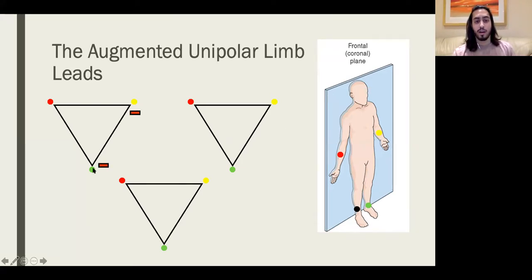So say on the left arm and the left leg, you have 2 negative electrodes. That's what the ECG, the clever machines, put in place. You have a positive electrode in the right arm. Now we know that action potentials and the way you actually look at these leads always goes from negative to positive. But now we have 2 negatives. So what are we actually going to do? Well, the ECG is a really clever piece of kit and it basically formulates an augmented lead. So it makes a vector between these 2 negatives all the way to the positive. And that basically means it looks at the middle of the 2 of them.